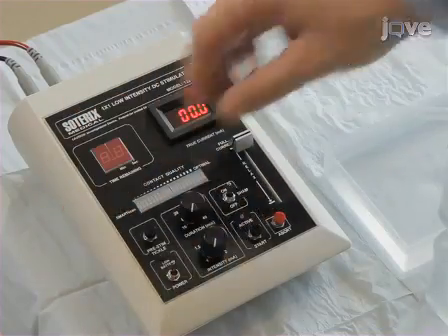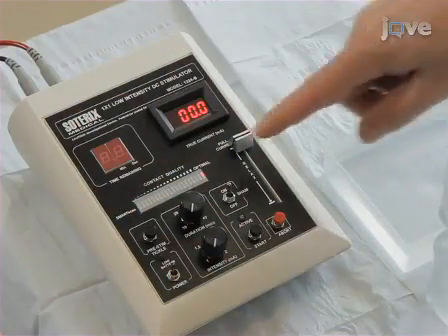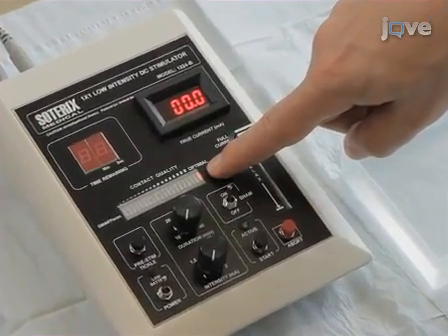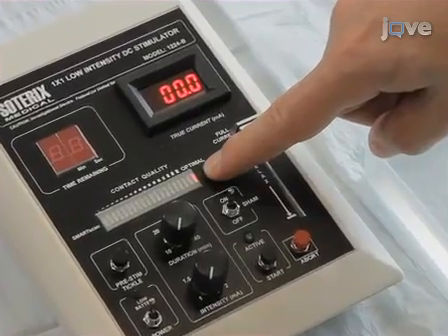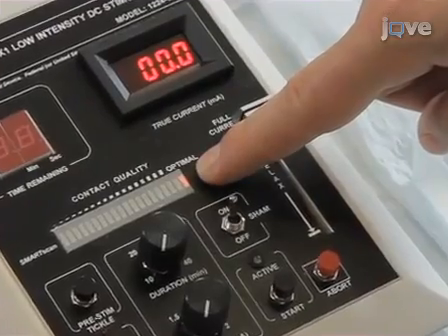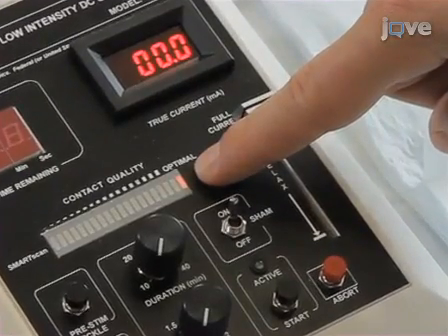Turn on the TDCS device. Use your system to measure the total resistance, being the sum of the electrodes and body resistance. If the overall resistance is abnormally high, this may indicate improper electrode setup. Ideally, aim to have the impedance under 5 kiloohms.